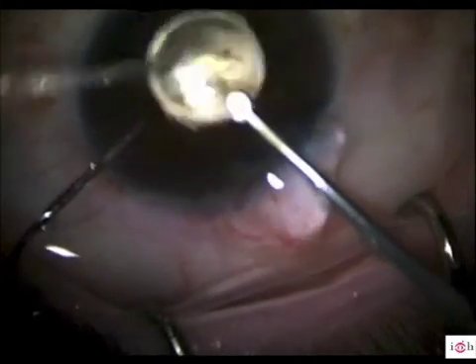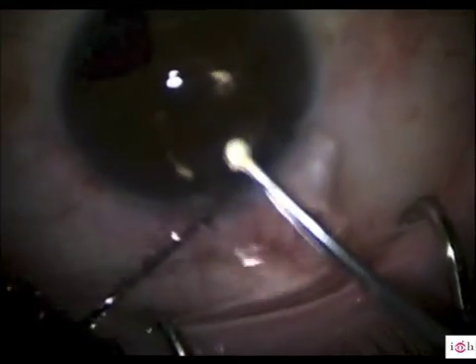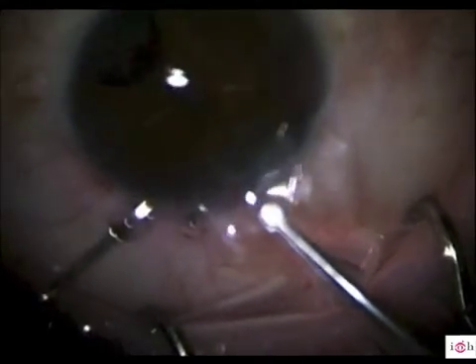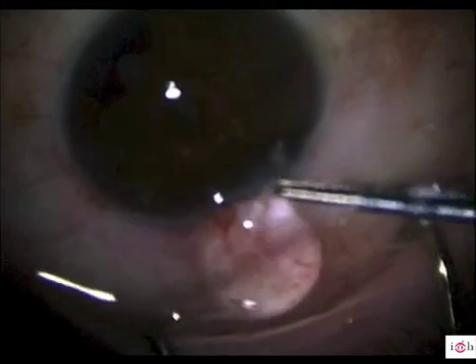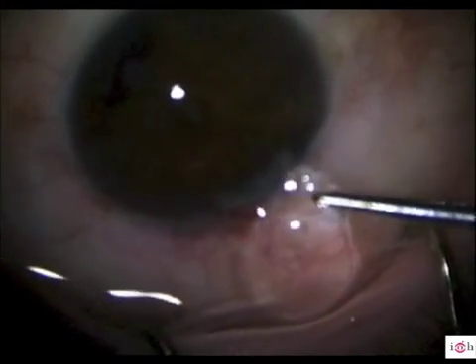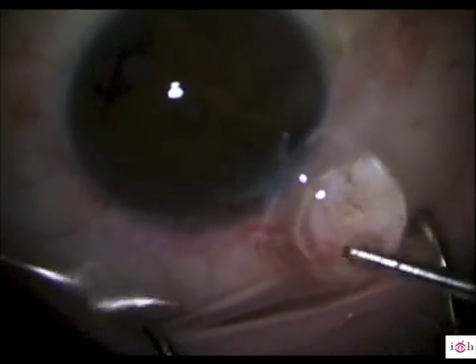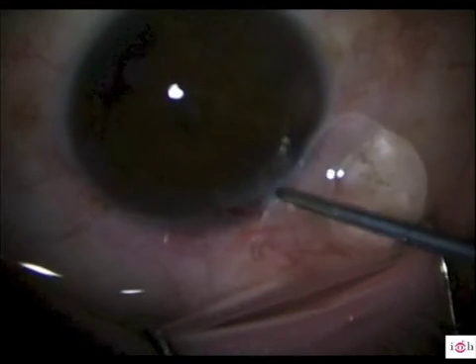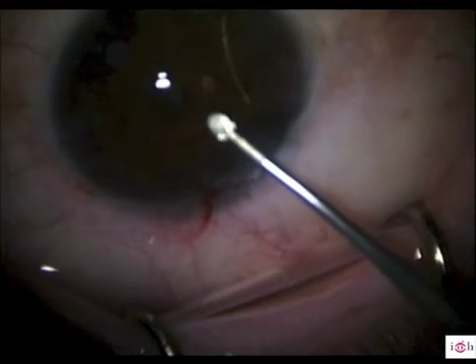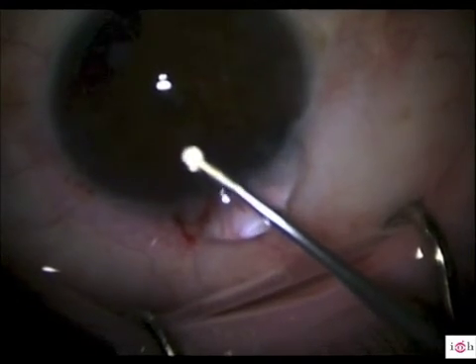We removed the IOL with the type of forceps used in the time of extracapsular surgery to implant rigid PMMA intraocular lenses. The superior haptic was still trapped in the iris, and we managed to remove it with gentle maneuvers following its outline. We tried not to damage the iris.